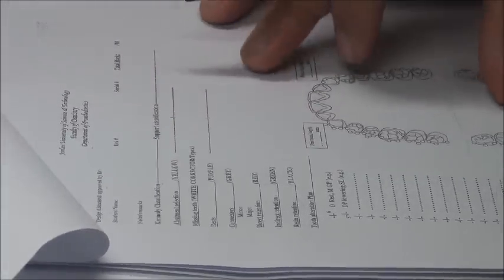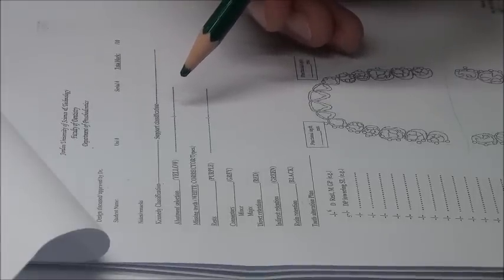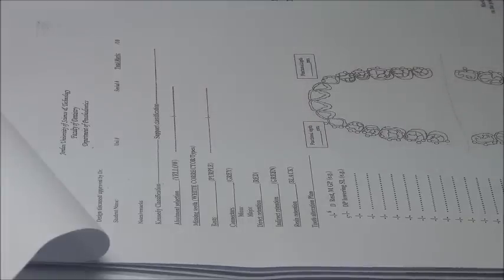As well, the support classification. Because even when the Kennedy classification is a class 3, for example, okay? Class 3 will not tell you the number of teeth missing. So if it's an extended bounded saddle, the type of support is different. Although we call it bounded, four teeth or more shifts the way the metal behaves under force, because of some inherent flexibility in the metal itself. This inherent flexibility will make it press on the tissue the way a free end saddle does. So there will be minor movement in long bounded saddles.